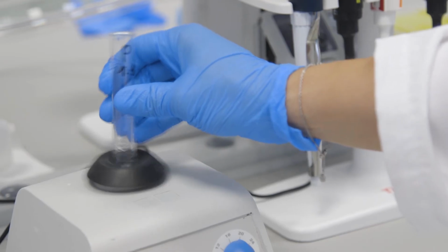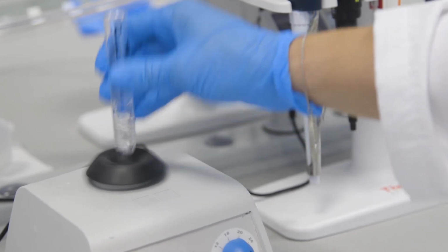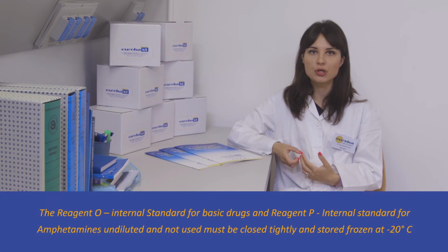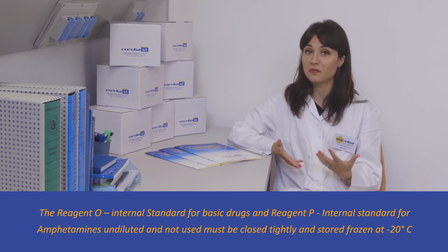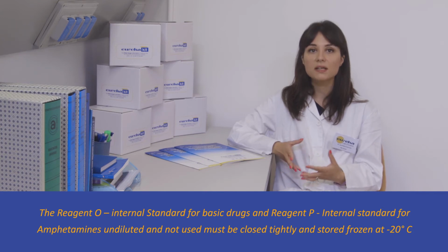Vortex for at least 10 seconds. The solutions are now ready for use. It is important to remember that reagent O, internal standard for basic drugs, and reagent P, internal standard for amphetamines, undiluted and not used, must be closed tightly and stored frozen at -20 degrees Celsius.